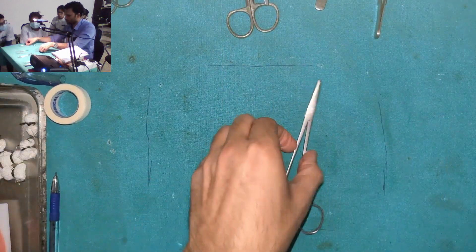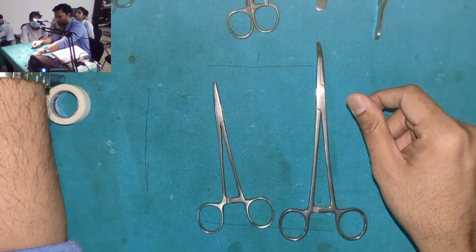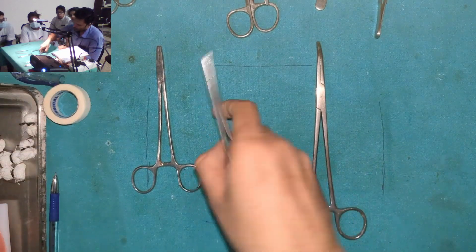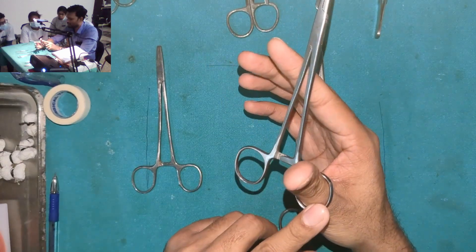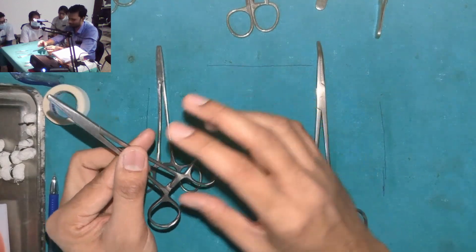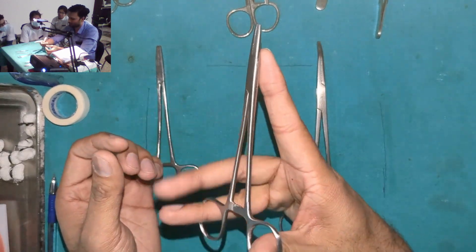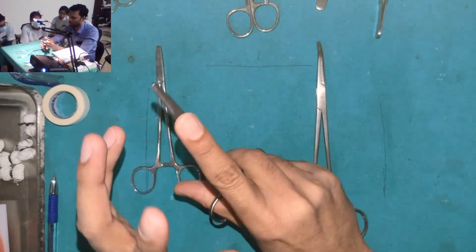Now, how to hold any such instrument — be it an artery forcep, a needle holder, or a wire twister. You can see the mechanism; the shape is somewhat similar for all three instruments. You have rings here. One ring is for your thumb, and the other ring is for your ring finger. Your middle finger sits right in front of this ring.